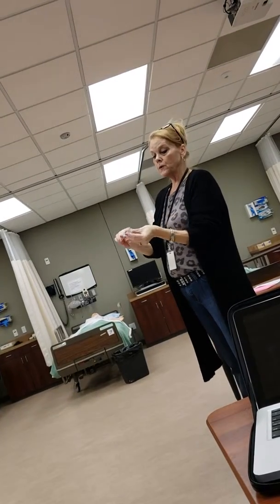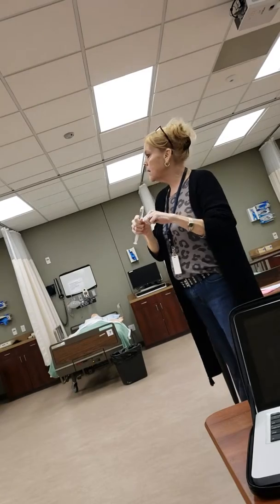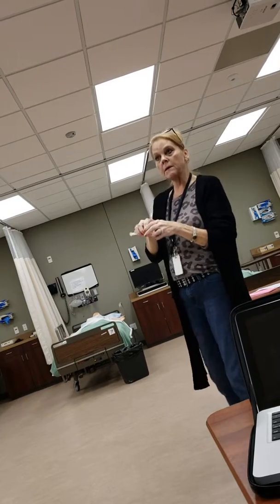Okay? So you'll look on your syringe, you'll scrub your hub. You've already flushed it, you've already checked your patency, you've already done your first flush, you're getting the medicine. For our purposes, we are not scrubbing the hub each time, but in real life, you would scrub the hub every time you attached a syringe to it. But we're on a 15-minute time restraint, so we're not going there. But if you want to, verbalize: I'd clean the hub, I'd attach my next syringe.